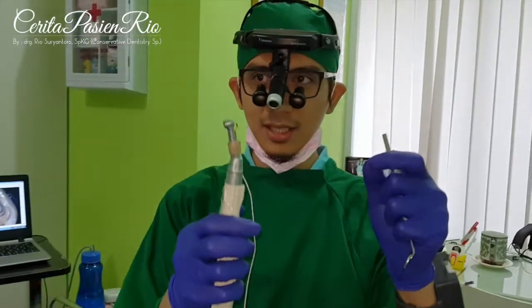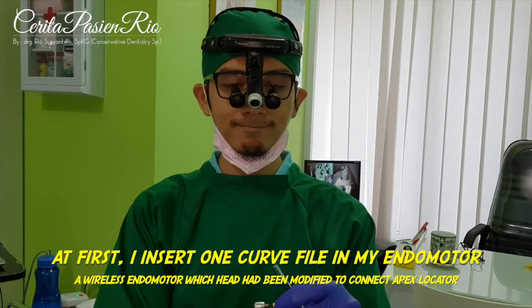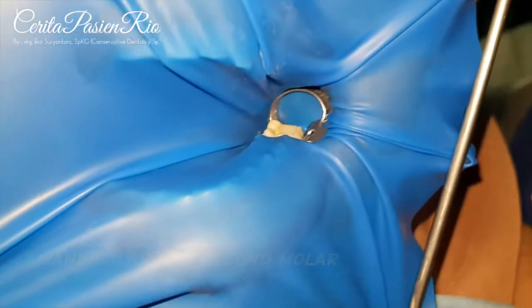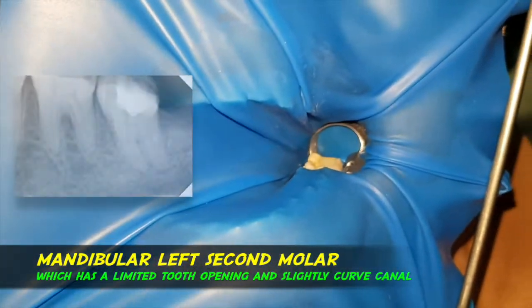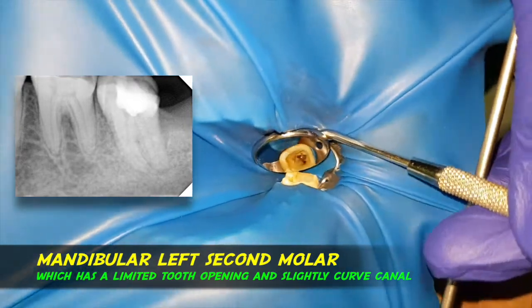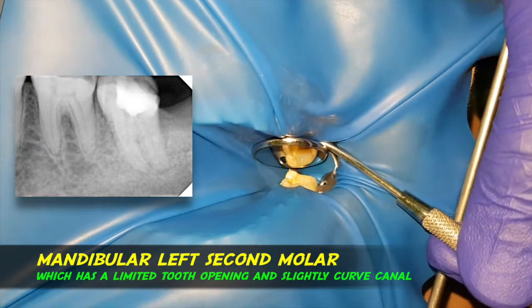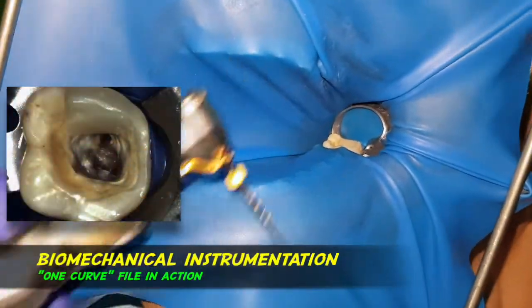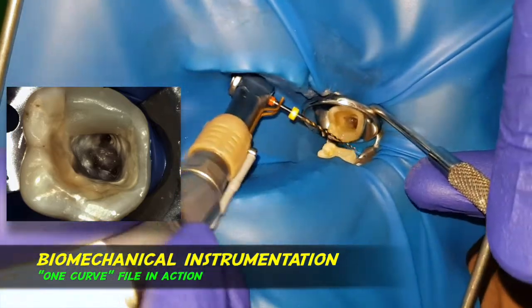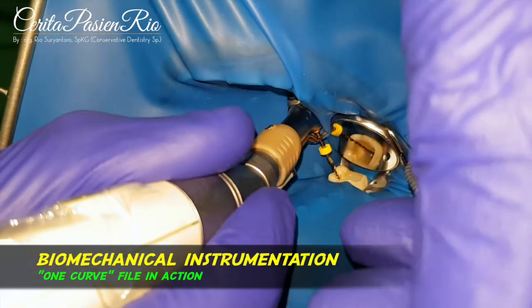First, I'm going to put this into my engine motor. Here's my vision. It has very limited tooth opening here — even my mouth mirror cannot stand here. This is the file. I'm going to challenge this file in the mesiobuccal canal. I have to do a little bit of yoga here. The mesiobuccal root canal.